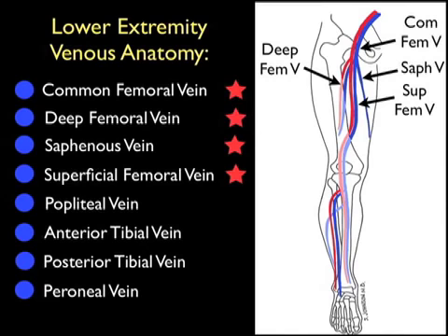to become the popliteal vein behind the knee. And we note the superficial femoral vein coursing down the leg and accompanied by the paired superficial femoral artery. Behind the knee, that superficial femoral vein will become the popliteal vein, and we see the adjacent popliteal artery.